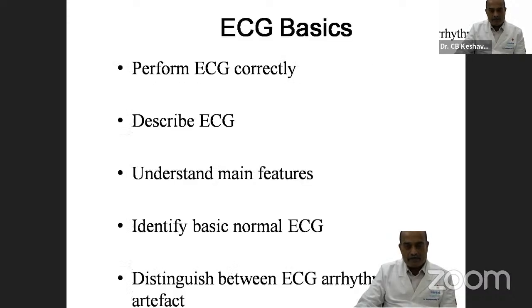So in this class, we'll learn about how to perform an ECG correctly, which is very important because different people take ECGs: the technicians, the nurses, and sometimes people who have not been trained to take an ECG also take an ECG. So we should be careful and probably supervise the first time an ECG is taken in your center.